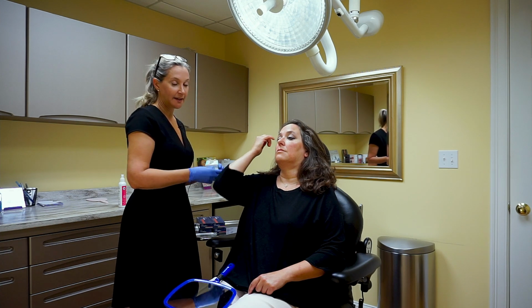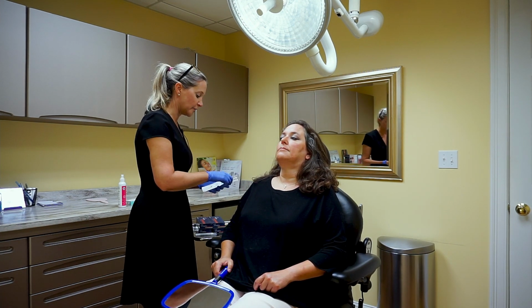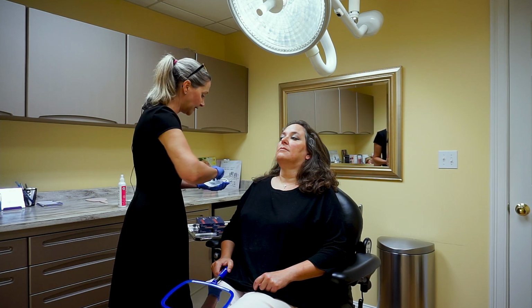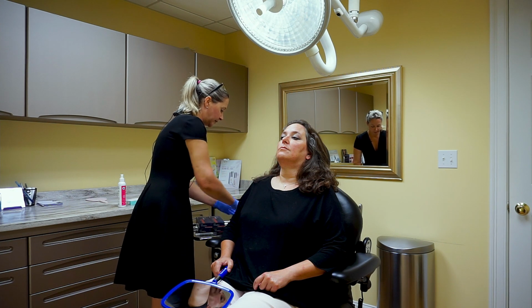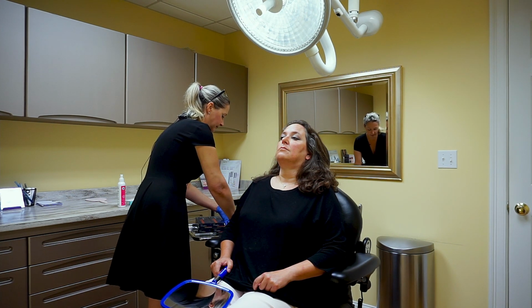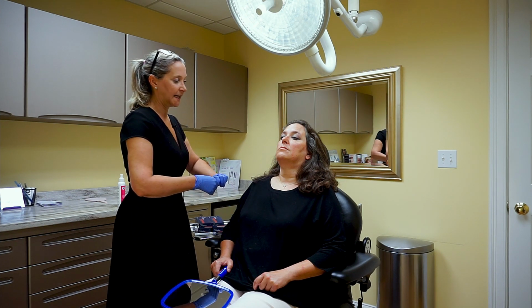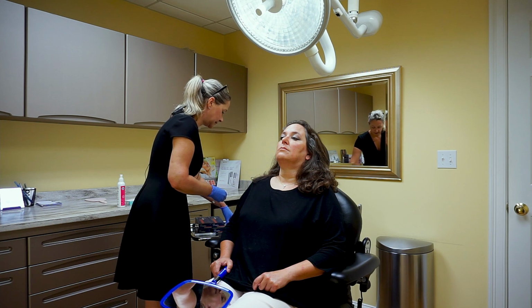Some people need that. There's definitely a whole practice of recontouring of the jaw, and you could really change the whole feeling that you have for the angular jawline, the demarcation between the chin and the neck, and those things, but we're not going to do that today. It's not necessary.